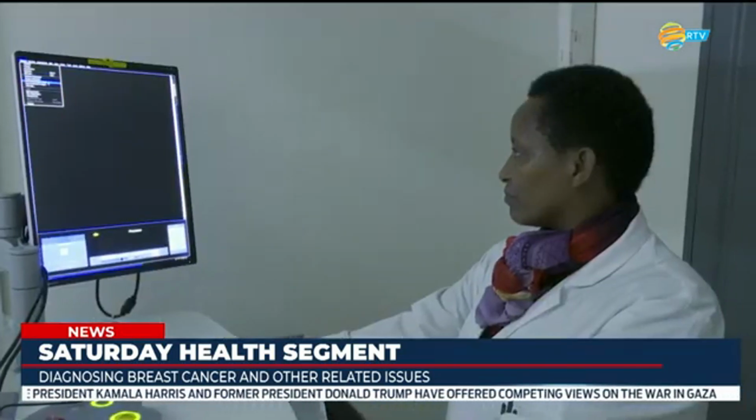So for diagnosis, mainly it is once the treating doctor, whom the patient consulted for pain or for another reason in the breast, finds there is a region like a mass, or if there is unexplained pain, that person is sent to us for an exam. So that is what we call diagnostic mammography. Then we perform the exam to add to the treating doctor's information.